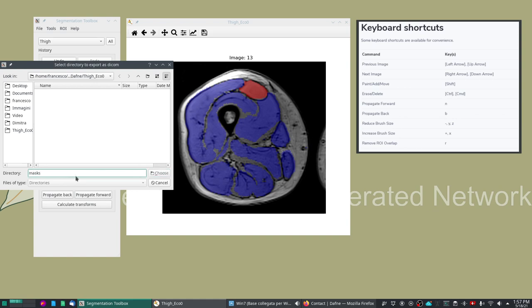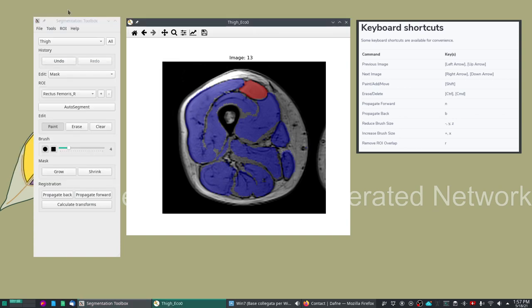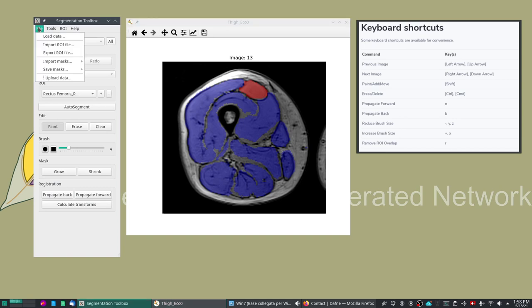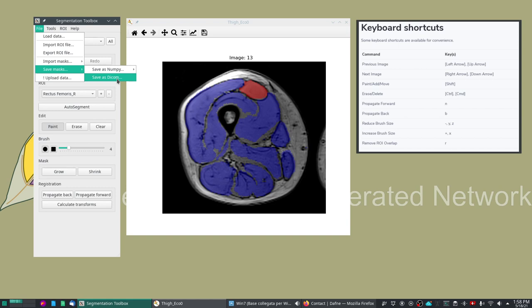I will not do it now because it will take a few minutes. Another important feature: if you save the masks as DICOM then you can import these masks on a different dataset. What I mean is if you have for example a quantitative dataset and you want to apply on these quantitative datasets the masks that were segmented on a different 3D dataset, you can do this.